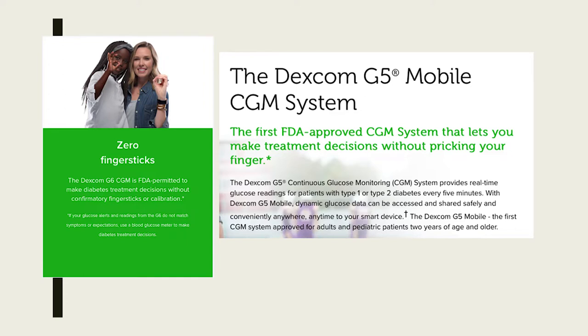So the upgrade, and the G5 is still available and a very good device, was also approved for non-adjunctive use. Originally these were approved for adjunctive use to blood glucose meters, so they were not FDA approved for making treatment decisions. By that I mean they were not approved for adjusting your insulin doses and deciding what dose to give. So they were listed as adjunctive. This one actually got approval for non-adjunctive use, meaning that the FDA said you can adjust your insulin based on that. And the Dexcom G6 has that as well.